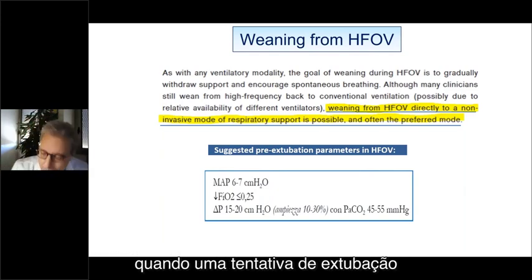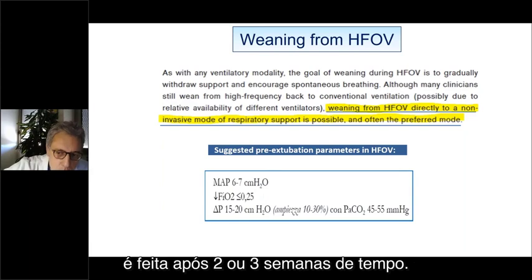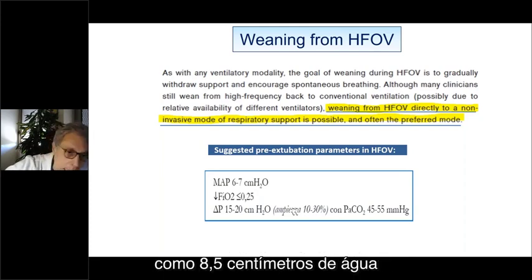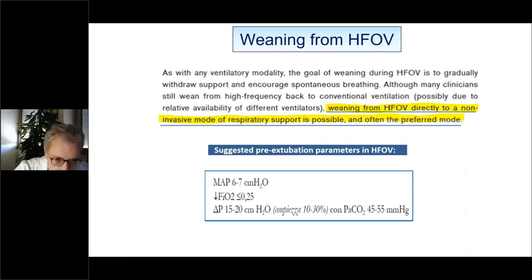Of course, when an extubation attempt is made after 2-3 weeks of time, we tolerate higher values of mean airway pressure, such as 8.5 centimeters of water, before attempting an extubation.